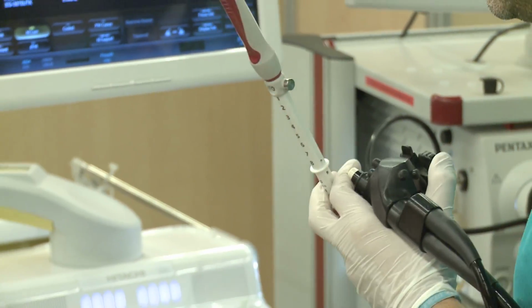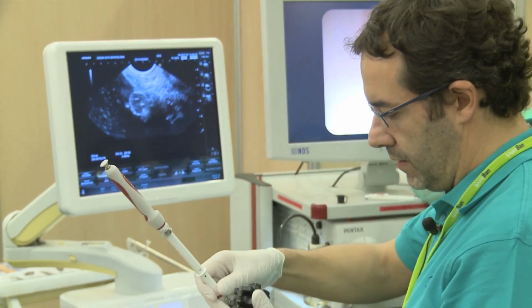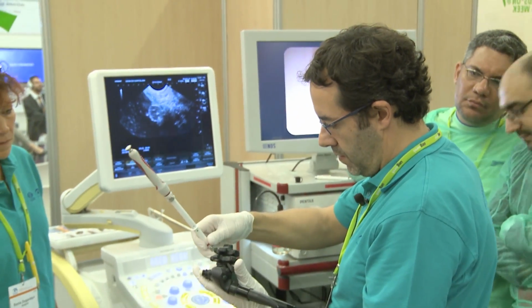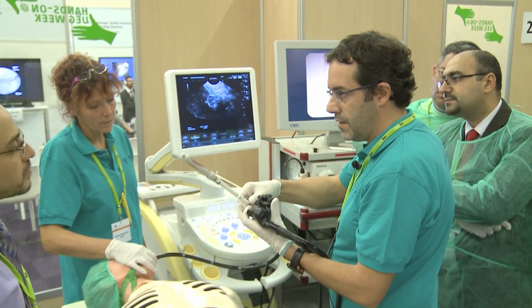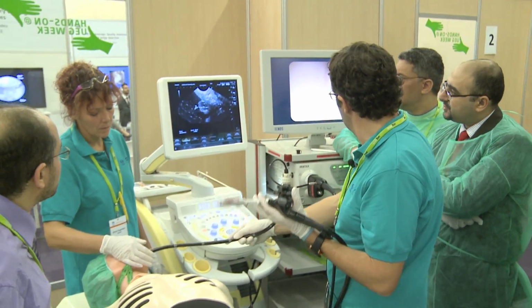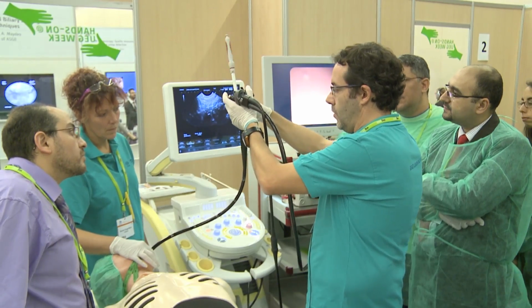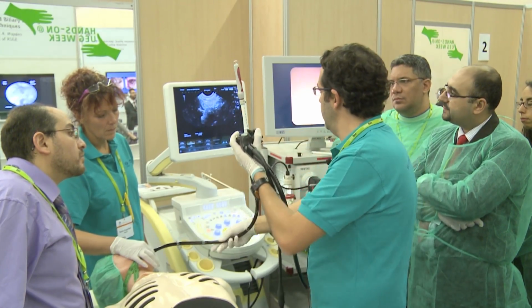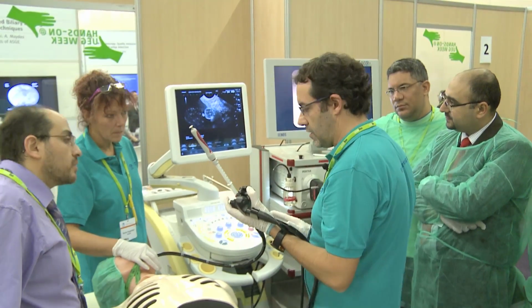No. If you have a good position, okay, like this, no need. The first you need to go inside. Okay? And only if you have any difficulties, you can just try to adjust to make the needle go in, and then try to relocate. But believe me, it's not such a complexity.